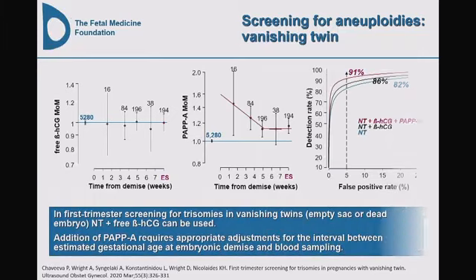Well, can we use the combined screening test? And what does that mean, the combined screening test? To use the ultrasound measurement of nuchal translucency and combine it with maternal age and with the biomarkers. This is a study that was a collaborative project between my unit in Bulgaria and King's College Hospital in London.